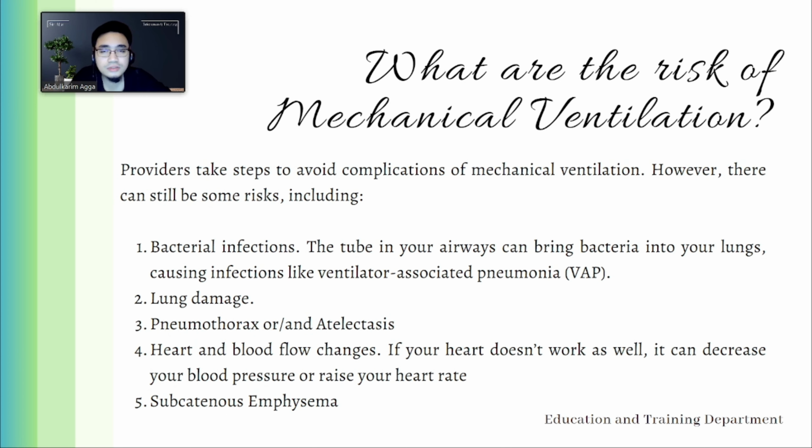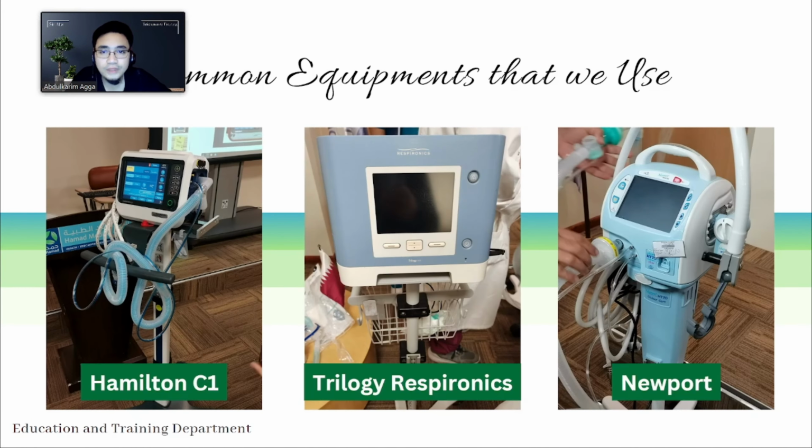And of course, in some rare cases, subcutaneous emphysema, because the newly inserted tracheostomy is not in place or not patent, wherein the air seeps into the subcutaneous tissues of your neck area. So these can cause complications in your mechanical ventilation.